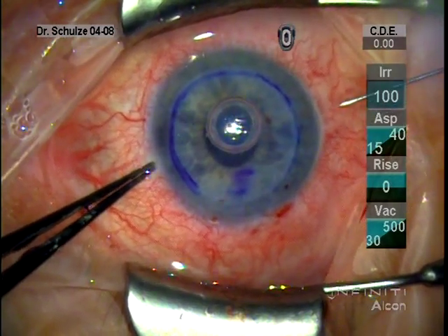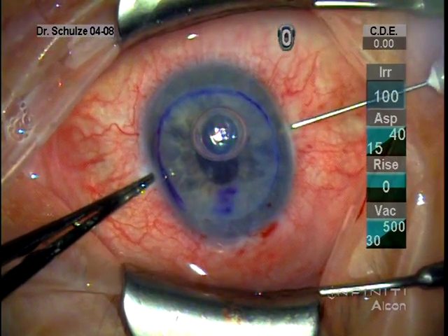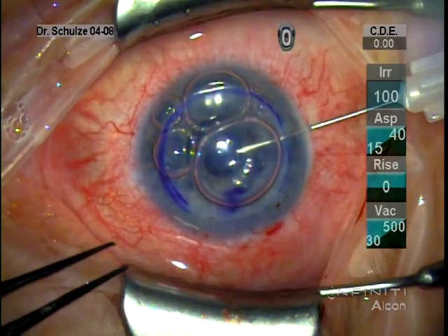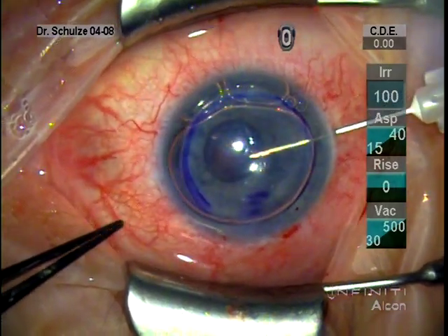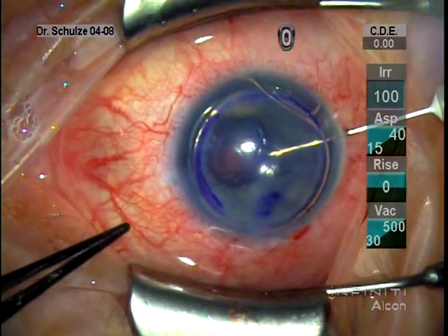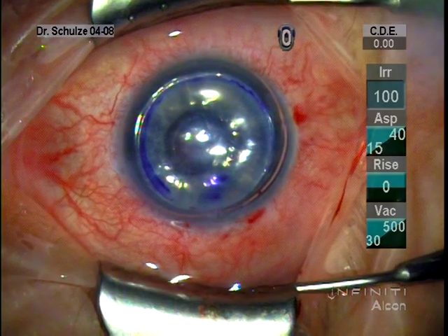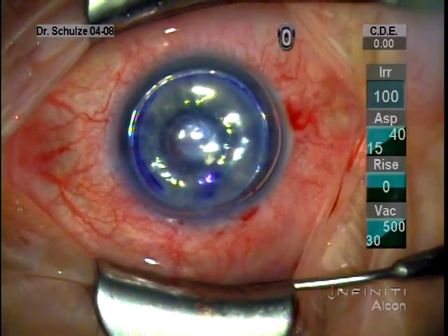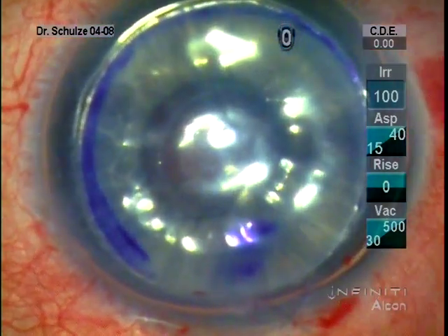Although you can inject your air bubble through the side port, I prefer to use a 30-gauge needle just posterior to the limbus and again underneath the donor for my complete fill. I find that with a 30-gauge needle there is less leakage around the needle tract and I'm able to get a more firm fill into the anterior chamber. I did start off years ago using an 8-minute air fill, and now I'm down to a 4-minute fill with the bubble.